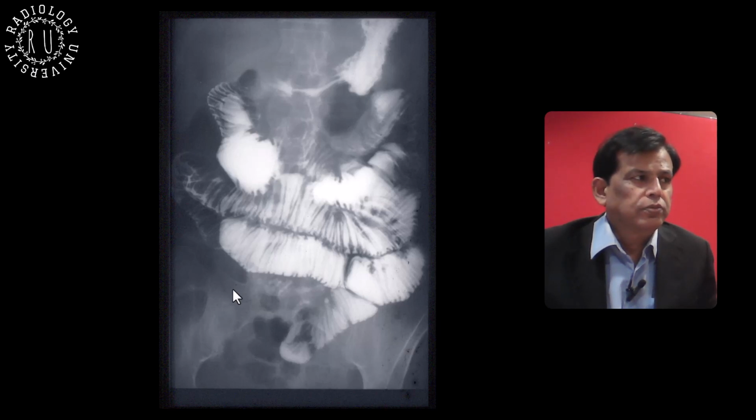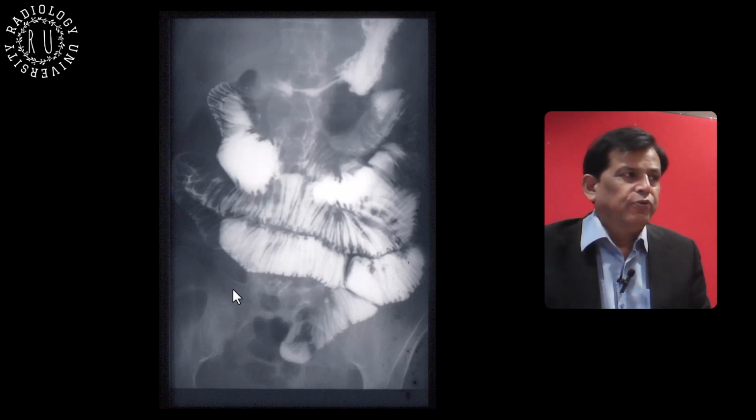Yes, in our residency we have done a few of them. Okay. So if I start... nowadays we do MRI more than this. Okay. So you have seen them before? Yes. So what do you think it is?